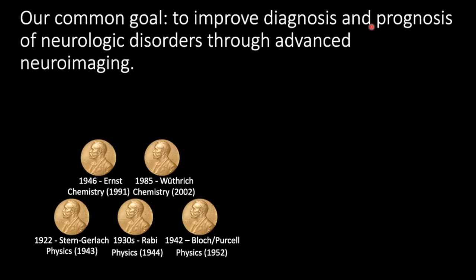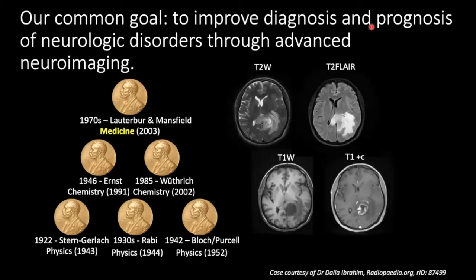But the Nobel Prize in magnetic resonance imaging, that is forming an image using these principles, was awarded in the area of medicine. And I think it's really important to highlight that the ability to visualize soft tissue is fairly unique to MRI. It makes what we do a real and somewhat unique opportunity to look at all the organs of the body, but in particular the brain.